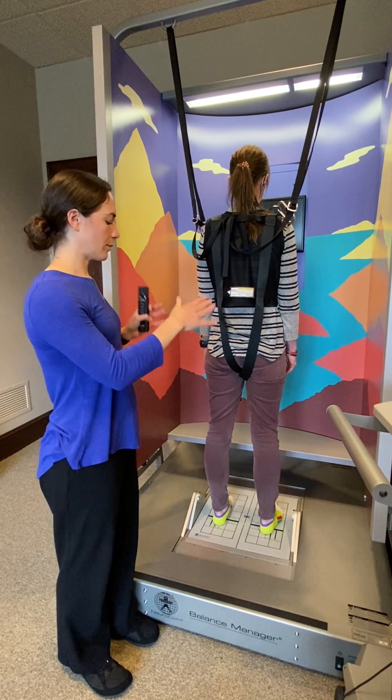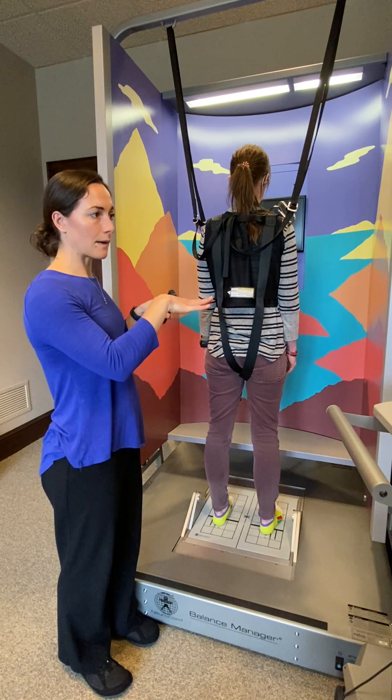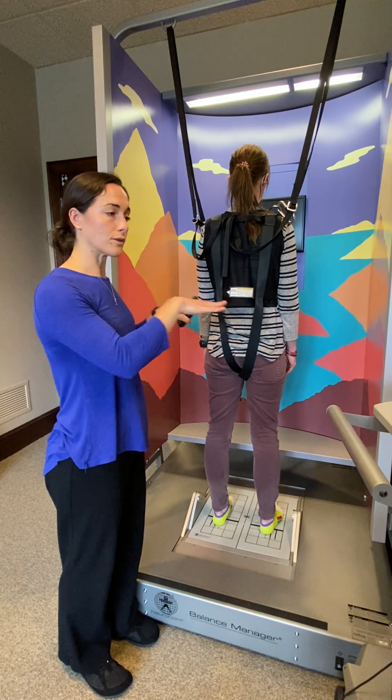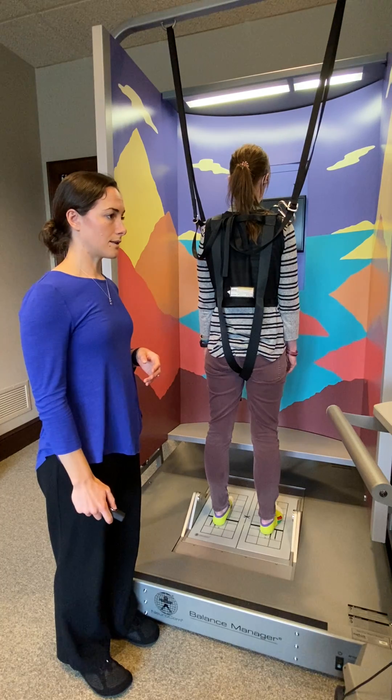The plates with this test will move in three different levels: small movements backward, medium movements backward, and large movements backward, and then also three levels forward. So let's show the medium sized movements backward.